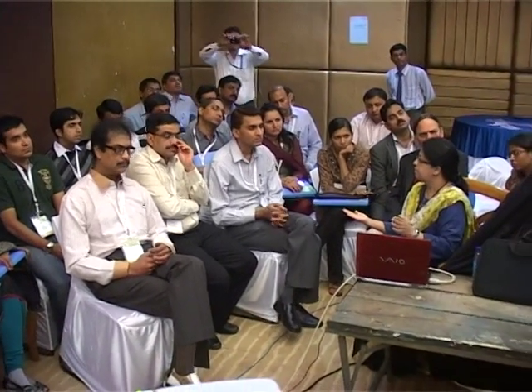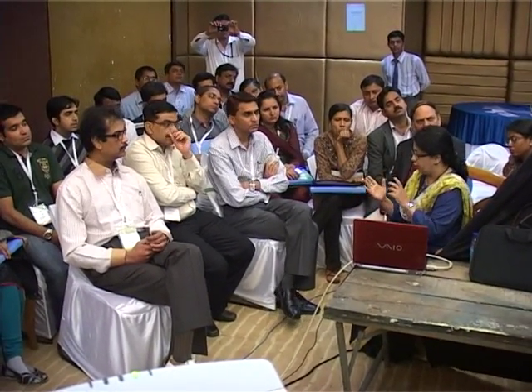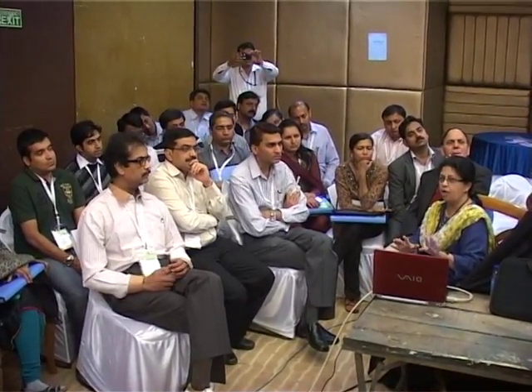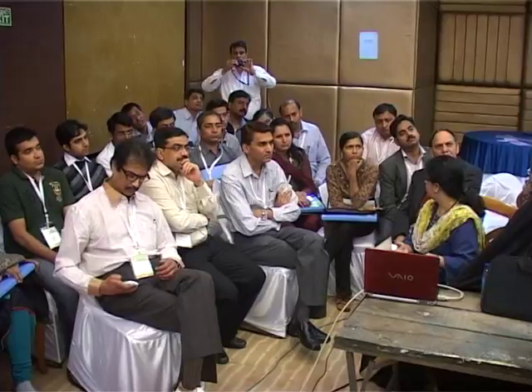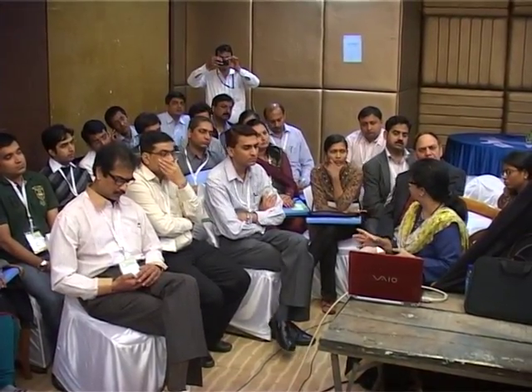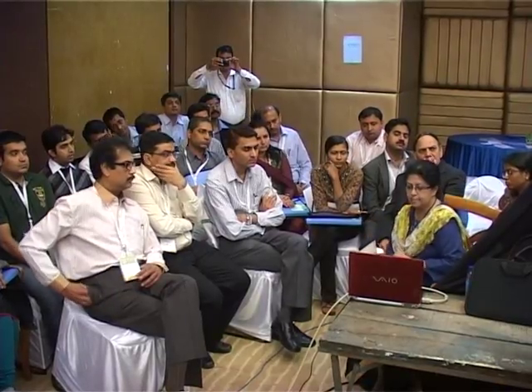As soon as you put the patient on the ventilator, do a first ABG, and then do another ABG after 1 to 2 hours, so that you find how the patient is reacting to your settings, whether that is adequate or whether there is unnecessary washout of CO2 or whether there is accumulation or acidosis. You have to check that and fine tune your settings.